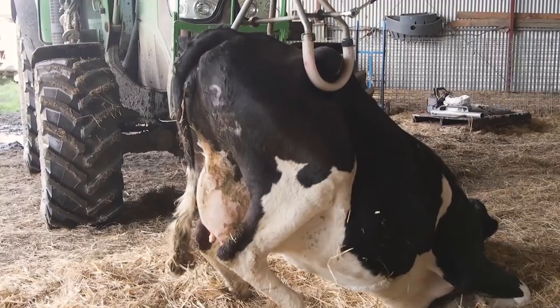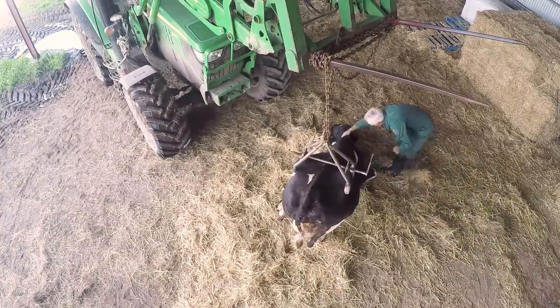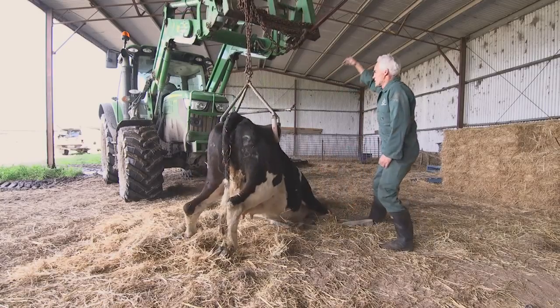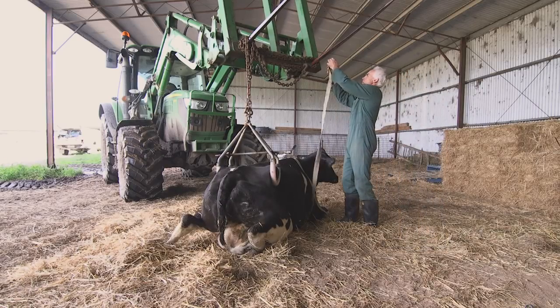At this point many cows will stand taking full weight on their front legs, unlike this one. With encouragement she may, but if not we need to apply a chest strap. It's important when encouraging the cow to take weight on her front end not to lift them high in the air by the back end, as this may damage the cow.